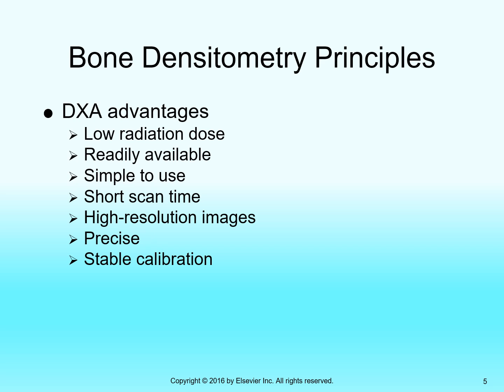And so there's not a lot of scatter created with a highly constricted beam. And so the image you do get is high res. But again, that's not where the real important information is. The real important information is in the analysis, the charts, the graph, the data tables that accompany the high resolution image. And then bone densitometry machines are precise, and what that means is it measures bone density consistently over time.